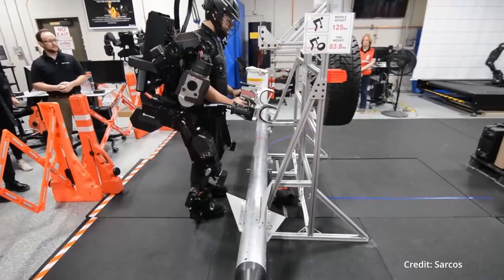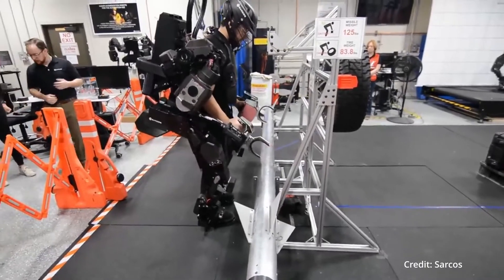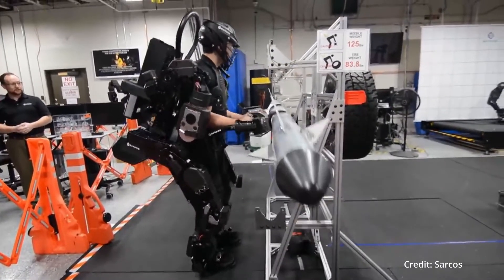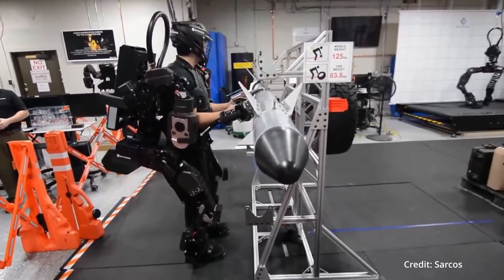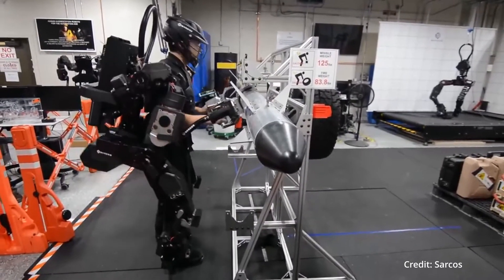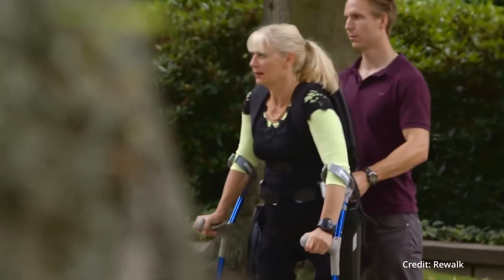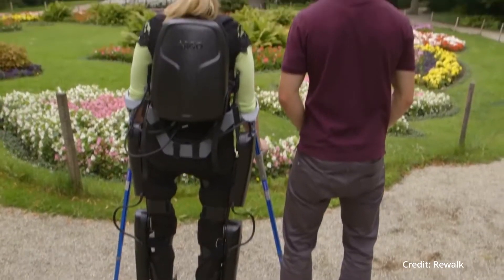But this is clearly not enough, and we would like for these people to be able to move again — to move their arms and their legs and to interact like healthy people with the surrounding environment. For this reason, we have to refer to exoskeletons. Exoskeletons are powered, wearable machines that can allow or support limb movements thanks to different motors — they can support a person lifting a heavy weight, like in industrial applications, but for paralyzed people they can allow limb movements when it's not otherwise possible.